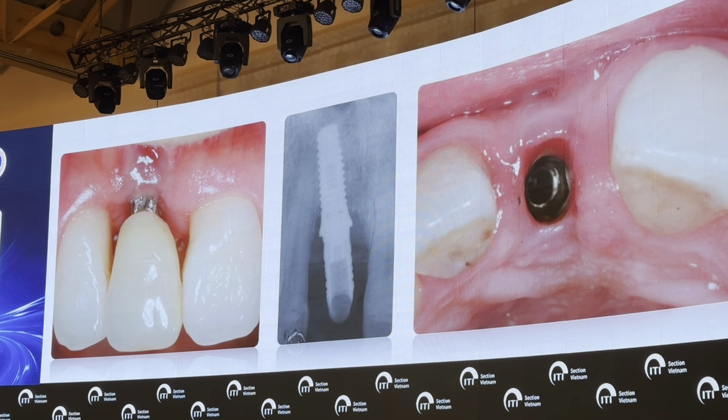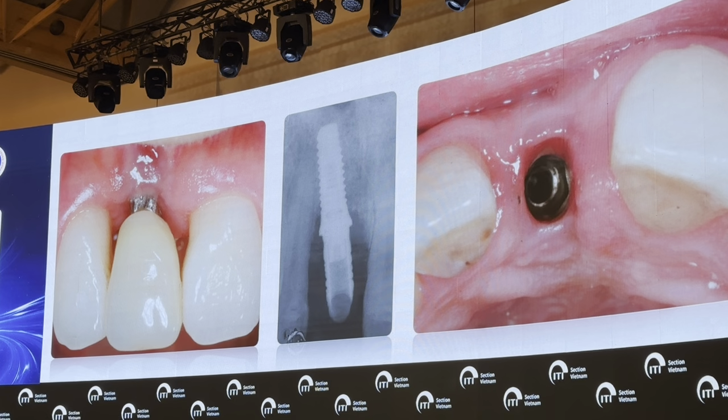So in a case like this one, in which the implant, as we already discussed, is placed in the right position because it is not too buccally displaced, but we have the complete lack of both papillae, especially the distal one, we don't have so many possible alternatives. So we started to think what to do in this type of defect, because again, when you treat this type of defect, the only alternative is to extract the tooth, the implant, not the tooth, the implant.